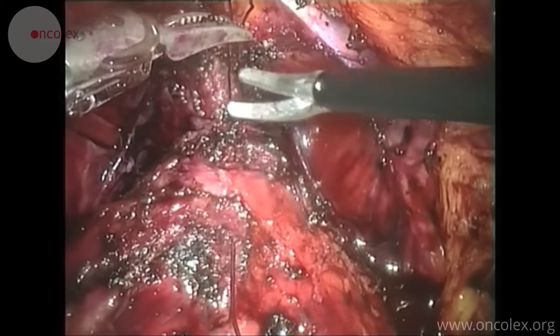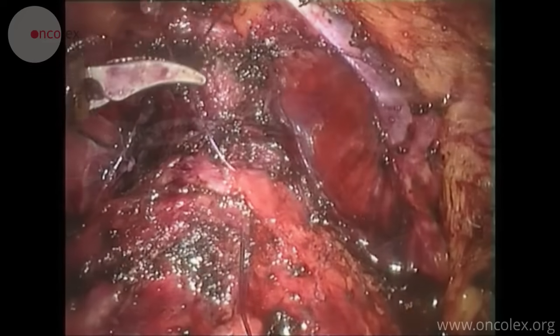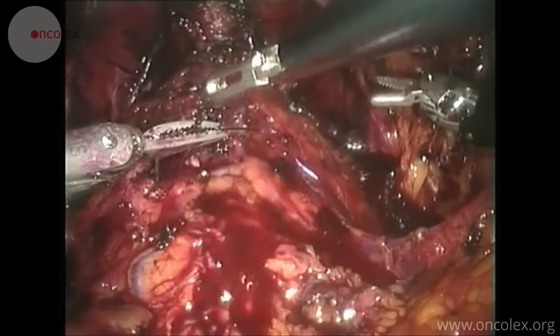After the knot is made, the surgeon tests the anastomosis with about 120 milliliters of saline. If the anastomosis is tight, a drain is usually not installed.